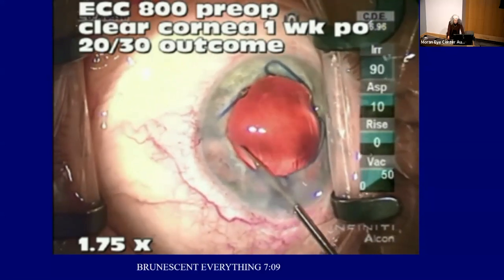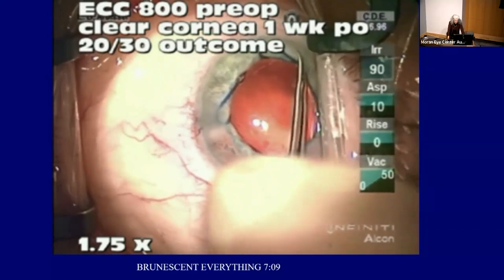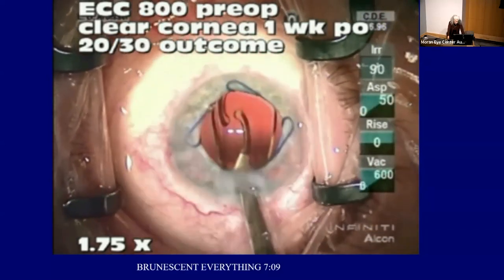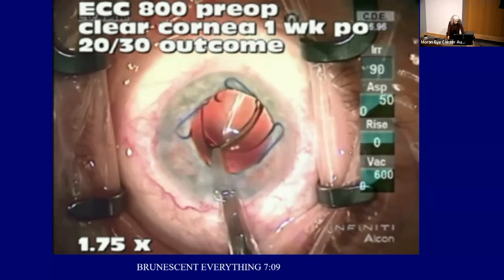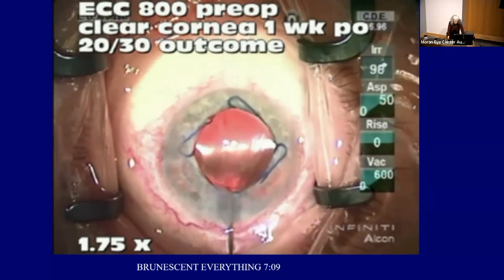Here I'm enlarging the capsulorhexis because it was such a marbly kind of cataract that I had made it rather small. Most of the time I'll enlarge after I have the lens in, but I thought it was even too small for that, I guess. In this case, we get that all centered and nice.